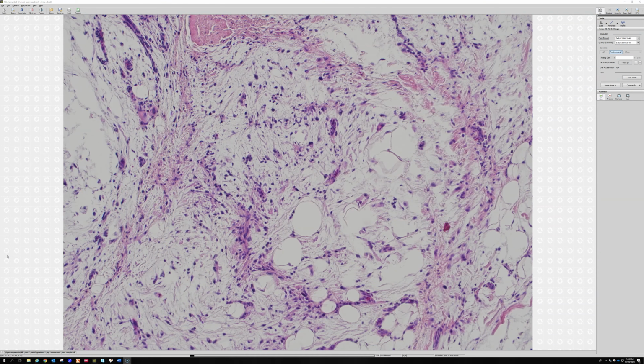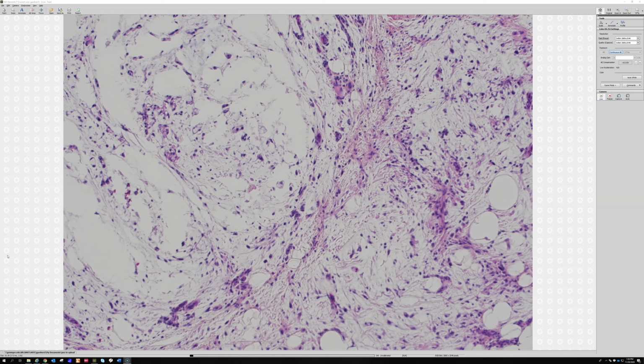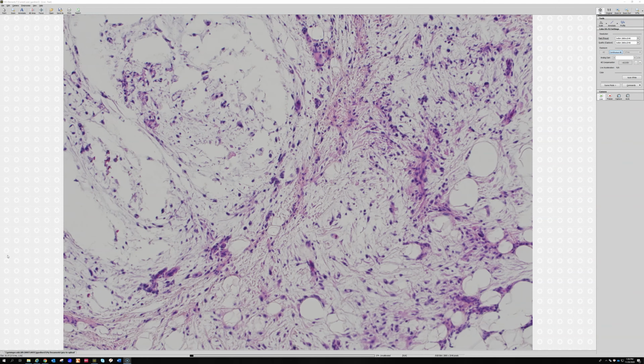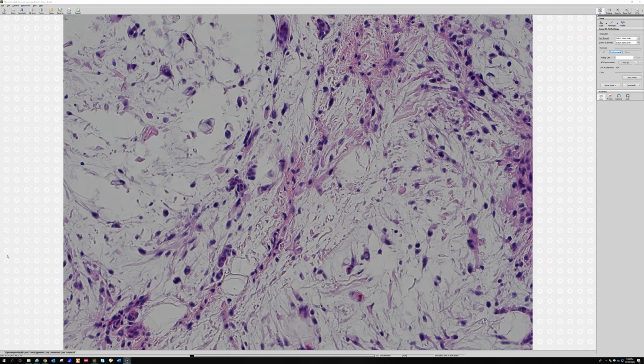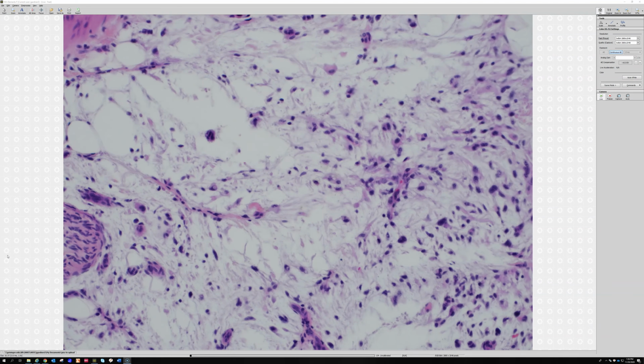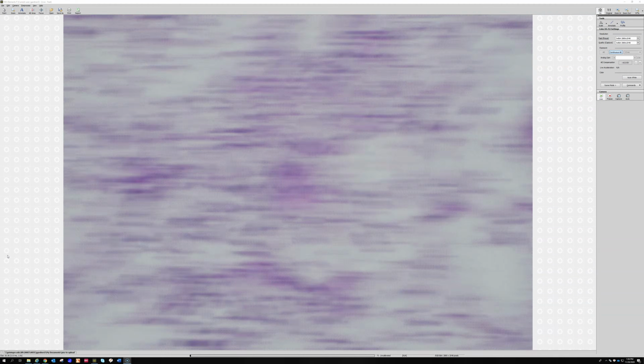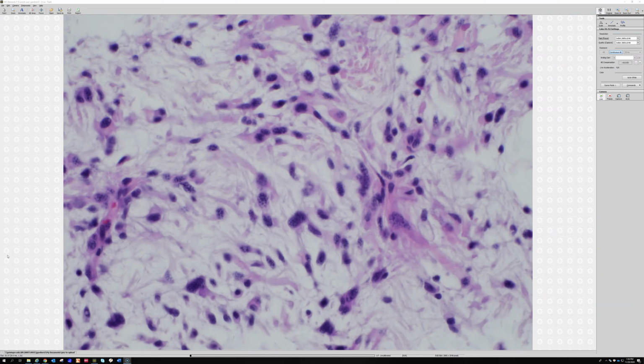I thought it's like a myxofibrosarcoma. Well, that's exactly what it is. Good job. You've got myxoid, very infiltrative growth. And if we go look around, even though it's not super ugly from low power, it's very hypocellular. When we look around, we begin seeing scattered, hyperchromatic, atypical cells.